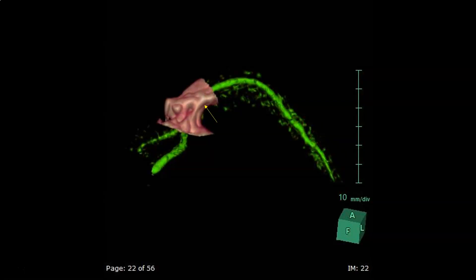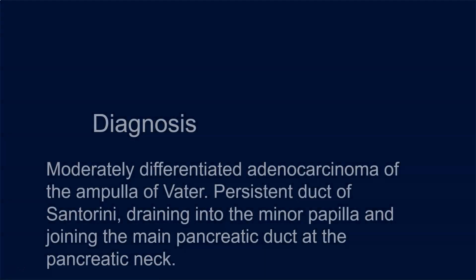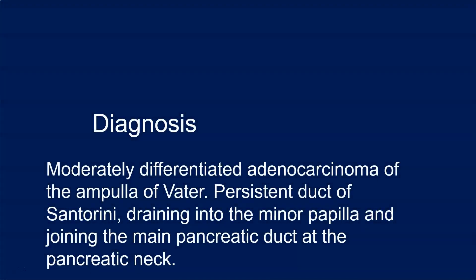Now the surgeons know that at the concavity formed at the pancreatic parenchyma by the superior mesenteric vein — a very good landmark — the duct of Santorini joins the main pancreatic duct. Accordingly, the plane of section could be at the part of the pancreatic body immediately next to the pancreatic neck. The diagnosis is moderately differentiated adenocarcinoma of the ampulla of Vater, with a persistent duct of Santorini draining into the minor papilla and joining the main pancreatic duct at the pancreatic neck.